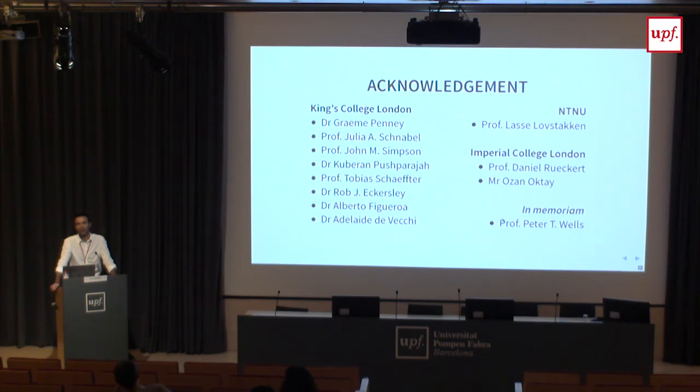Then, of course, you have to acquire things on the same day. So it's very difficult, I think. And then we did some work trying to do this comparison on phantom data, because I think that's the proper way to do it, because it will solve all these issues. And it's really difficult to come up with a phantom that you can see both in ultrasound and MRI. So we have tried quite hard and not been very successful yet. But it's an open question. So the short answer is they are a bit different. And probably Doppler is still not as accurate as MRI.